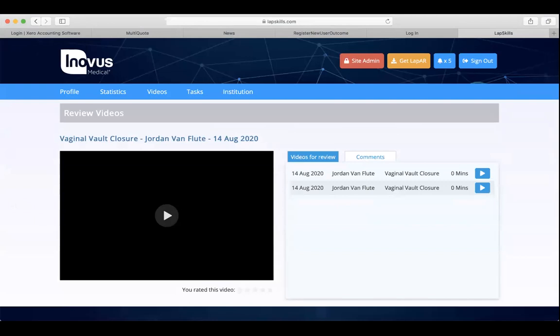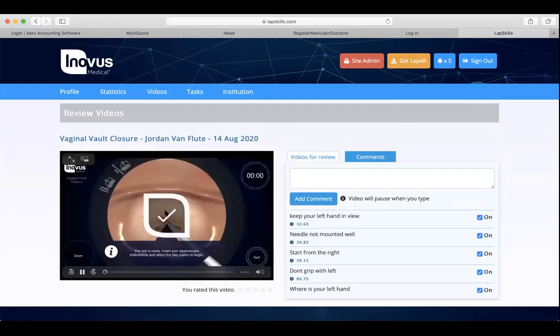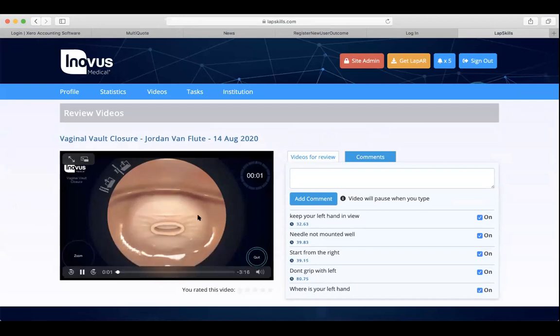And for example, if I'm the senior surgeon and I've got a video review invitation, I'm going to click view there. And hopefully this has got a video that will load. I apologize if it doesn't. Let me just click on that. There we go. So there may be a bit of a bandwidth lag there. But what you're going to see here is this video will now start playing. And I, as the video reviewer, the senior surgeon, may want to start typing. So the minute I start typing, you can see here that as soon as I've started typing, it has paused the video and it allows me to carry on writing my comment.